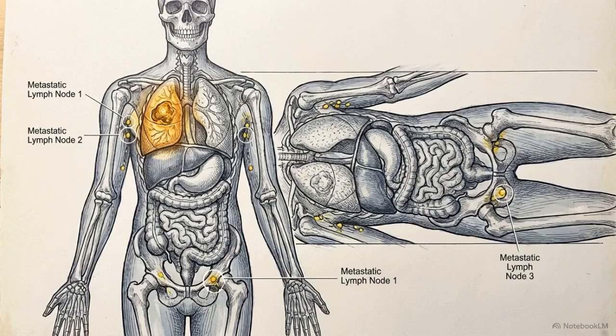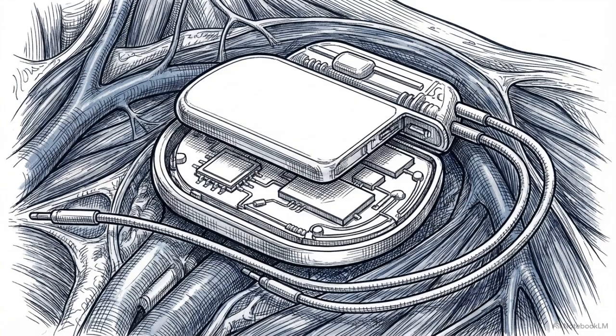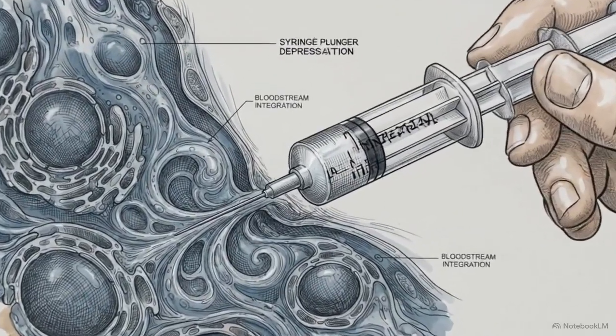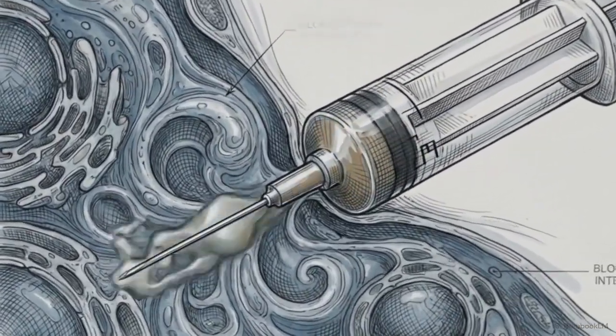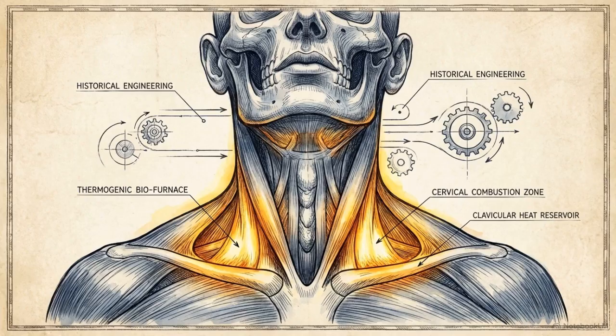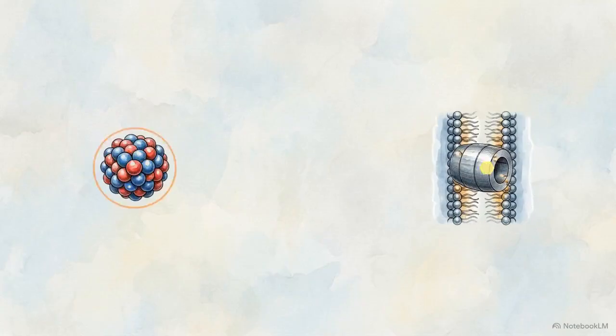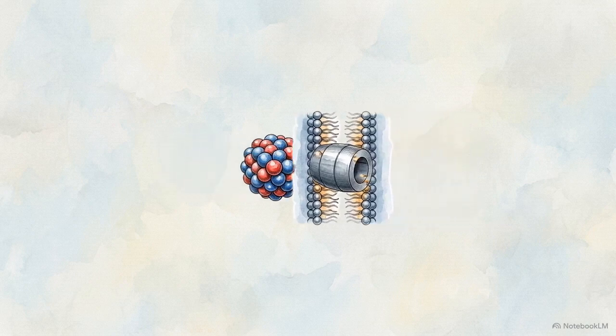The exam's utility lies in identifying distal metastatic spread and determining the total volume of viable disease. SUV metrics cannot be trusted blindly. They must be verified against the physical hardware density found in the raw, uncorrected CT data. The interpreter must also account for the biochemical state of the patient at the time of injection, factoring in systemic glucose competition, including insulin dynamics and sympathetic nerve tone. Ultimate diagnostic clarity is not achieved by trusting the machine's software. It is achieved by systematically deconstructing the physics and physiology that generate the image.